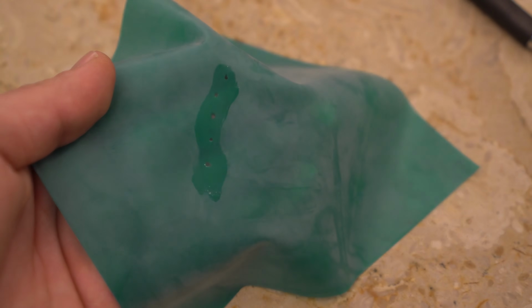Our last tip is to apply Vaseline to the rubber dam sheet on the inside surface before you apply the rubber dam. This does a few things. Firstly, it makes it easier for you to get the rubber dam sheet down through the contact points because there'll be less friction. It also means that the rubber dam sheet is less likely to tear when you have tight contact points.